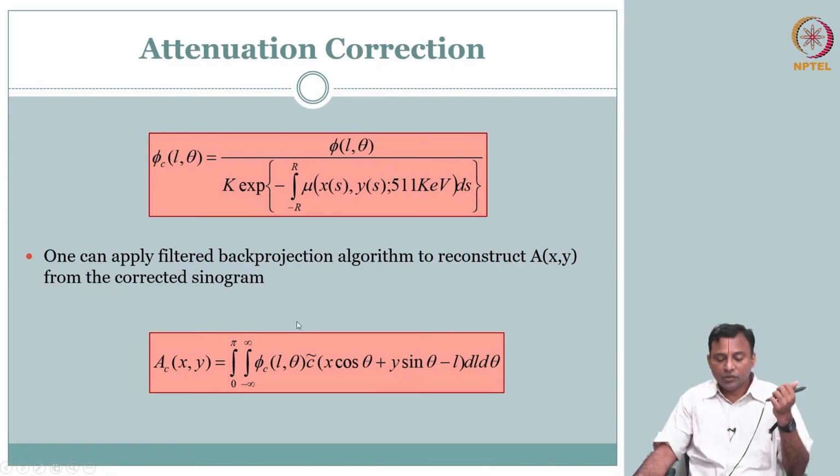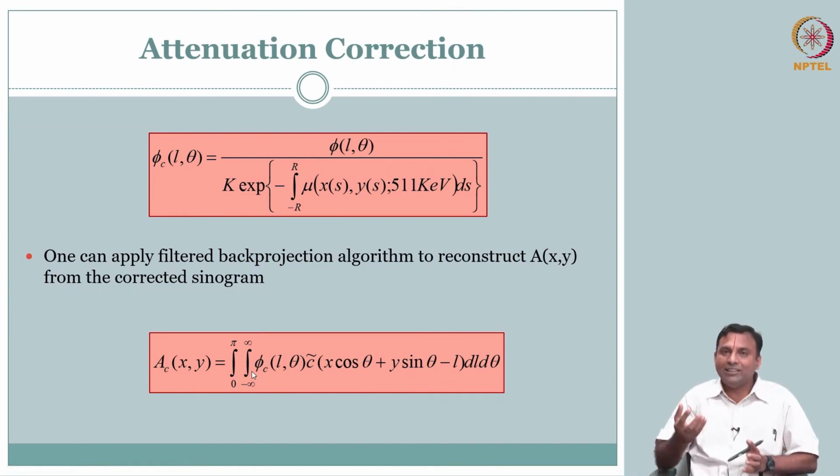Okay. So filtered back projection, convolution back projection is what is shown. You can use the same algorithm like before. So the only thing is how do you arrange the data correctly to use the same algorithm that you probably would implement, right. That is the key here. Otherwise, really the details of the algorithm reconstruction is very similar, or if you understood the CT, X-ray CT, it is a careful extension of that.